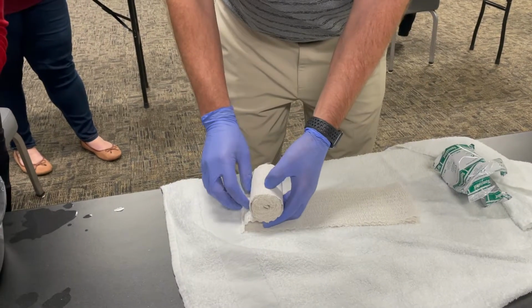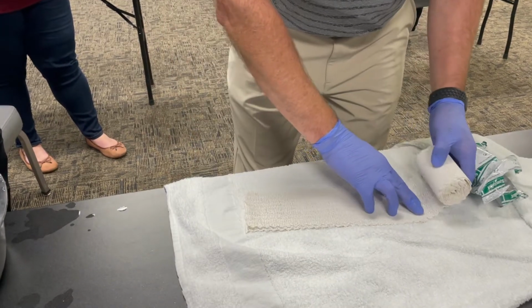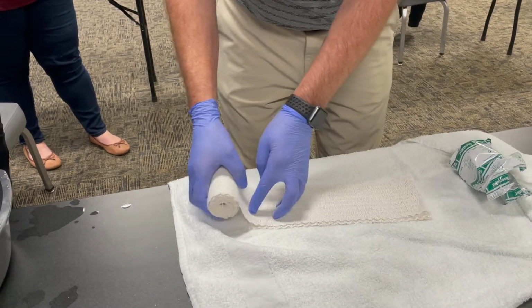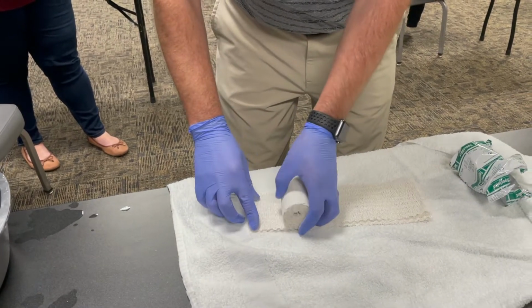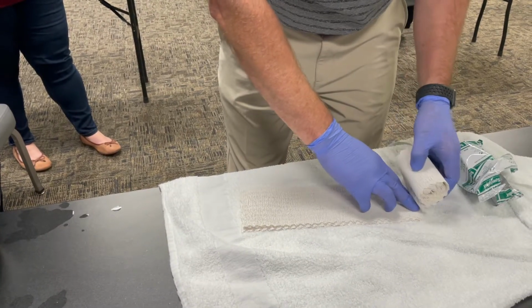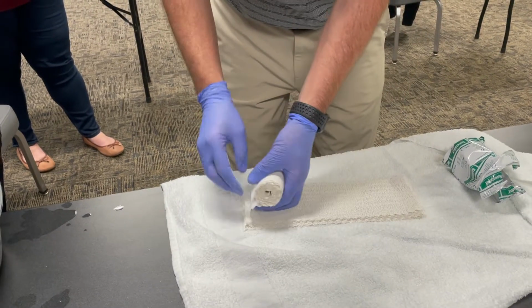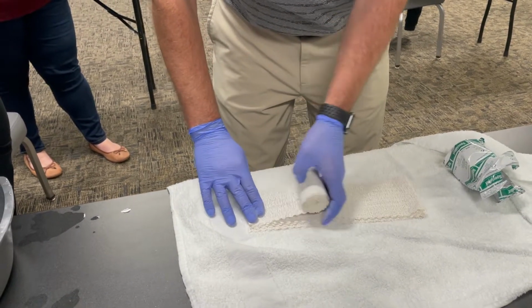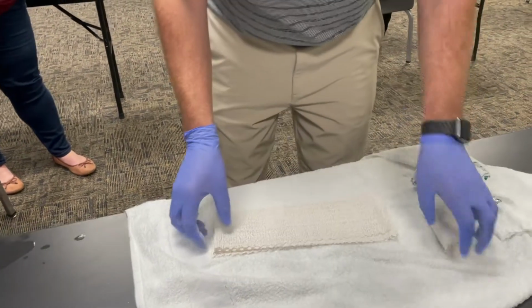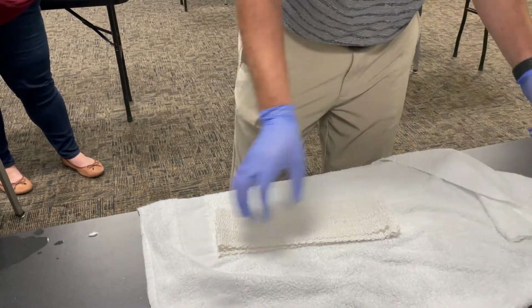I don't know with that white background, but I just don't want to get it all over the room. It's hard to tell remotely if you guys haven't used this. This stuff's messy. But like I said, it makes a really nice splint. It conforms nicely. So there are some pros to it. You don't have as much issue with pressure points because this stuff goes any way you want it to. When you get your thickness done, you just tear it. You don't have to cut it. All right, so we're going to wet this down.